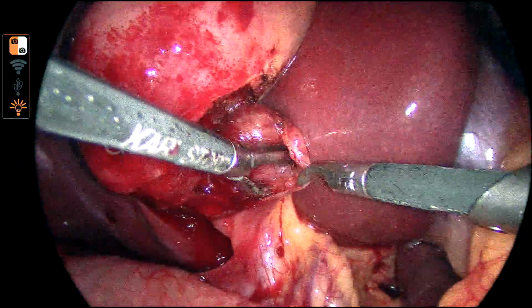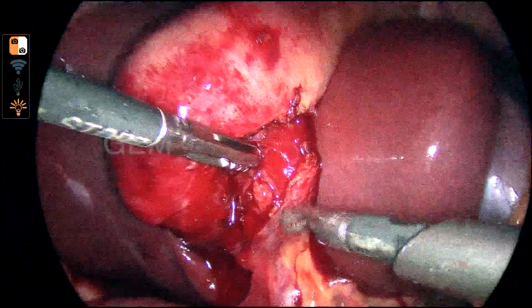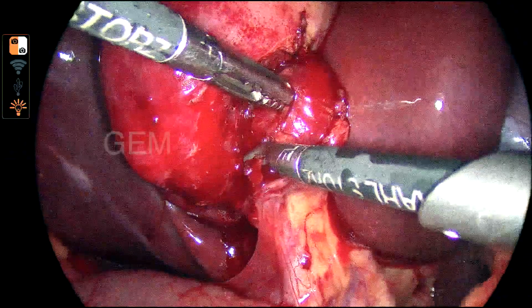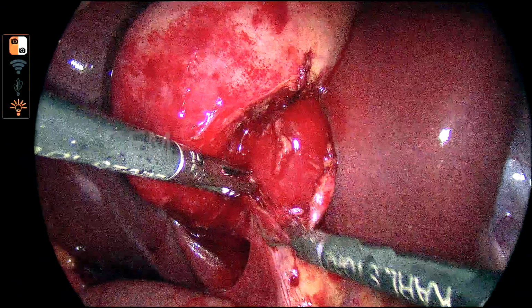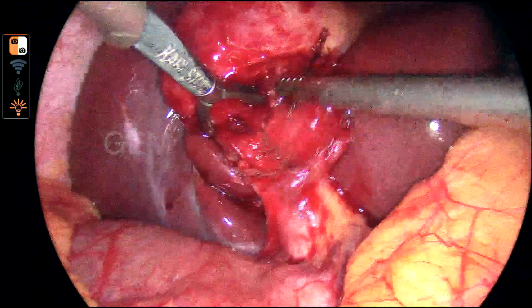If you have access, there is no need to mobilize and excise the node, and we can leave the node on the patient side. The only thing is, once exposure is there, we can coagulate, clip the cystic artery and then divide it without taking the node. That is an inflammatory infection, so it will settle.